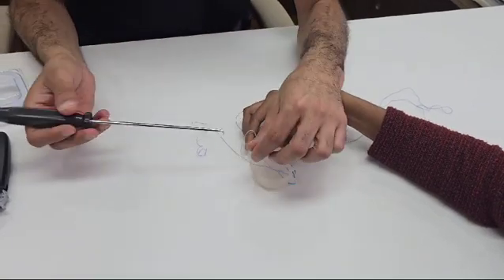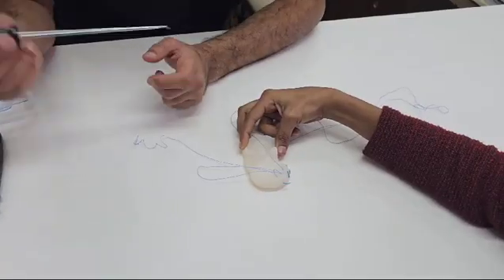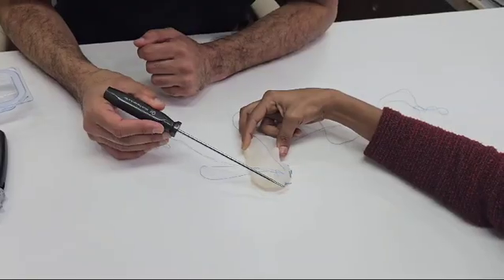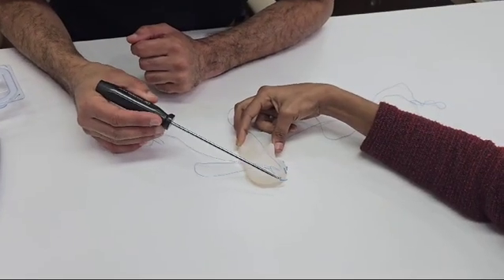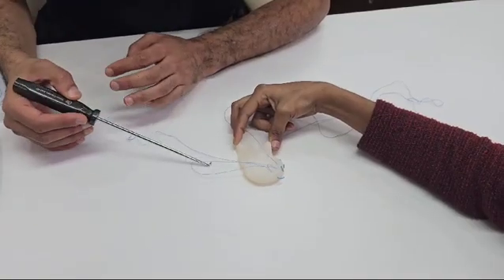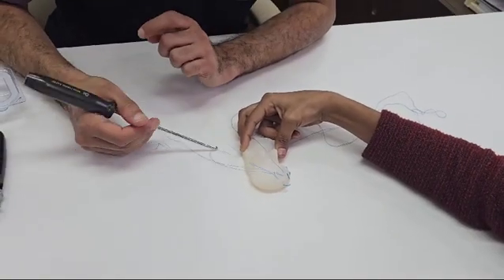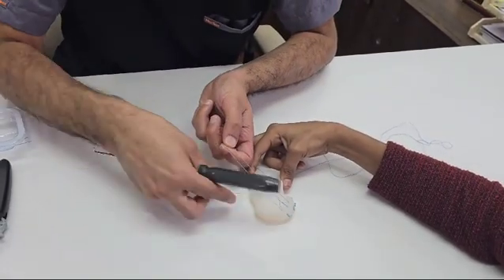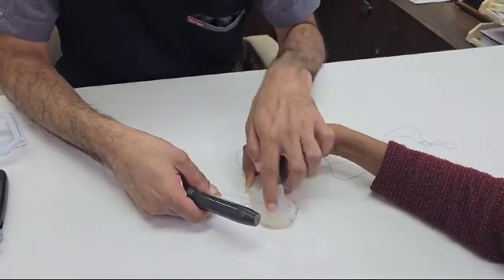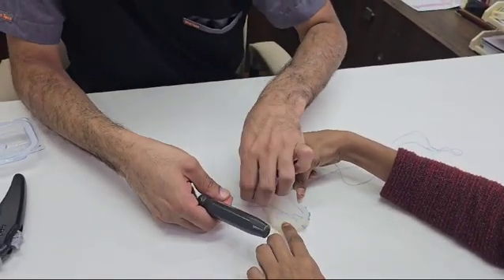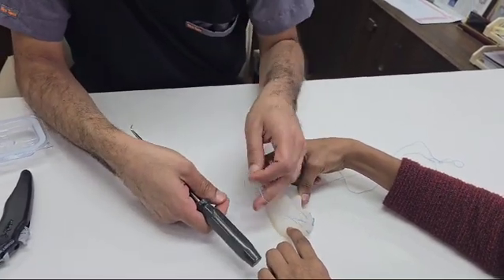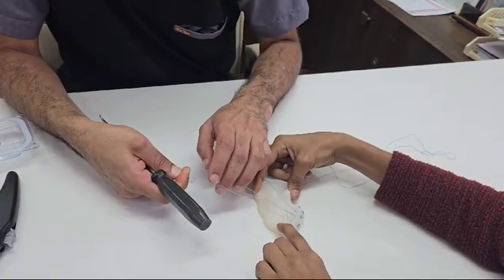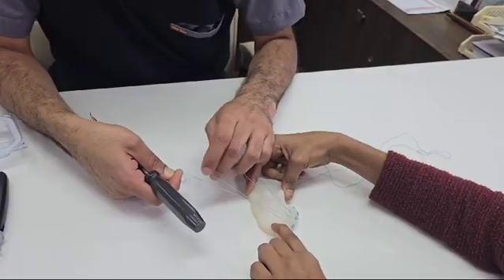Now what we want is we want both of these fiber stitch anchors to actually sit flush on the back of the meniscus. So for that, what we need is we need to pull this loop and this wire together. When we do that, we need to pull these wires together.